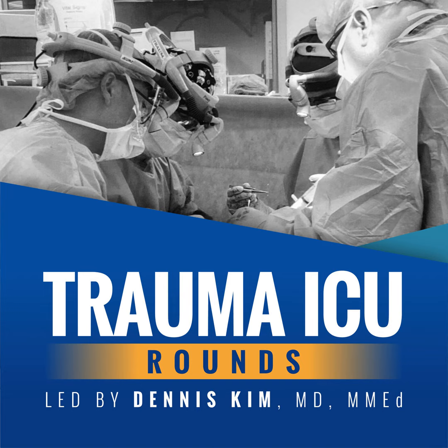With continuous mandatory ventilation, or CMV, as the name implies, all breaths are mandatory and can be volume or pressure targeted and are continuously provided by the ventilator. When would we use this mode? Well, in general, we don't. But you can imagine that in patients with severe ARDS and refractory hypoxemia, sometimes we'll administer neuromuscular blockade or paralytics in an effort to improve oxygenation.